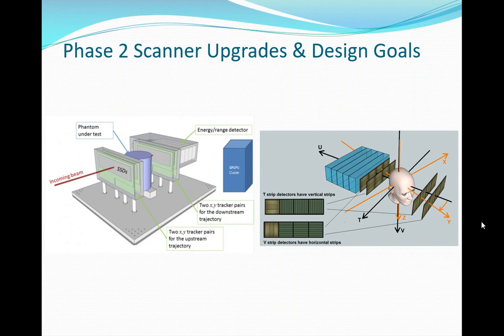Radiation that you can't see comes in, you get a whole ton of light for every single proton that passes by, or other ion, right? So they light up. We just put some photomultiplier tubes to detect the light inside those crystals, and we can read it out. The amount of light you get is proportional. We fire 1 proton at a time, so we can track them, a few nanoseconds between them, very fast readouts, and we're able to now predict.